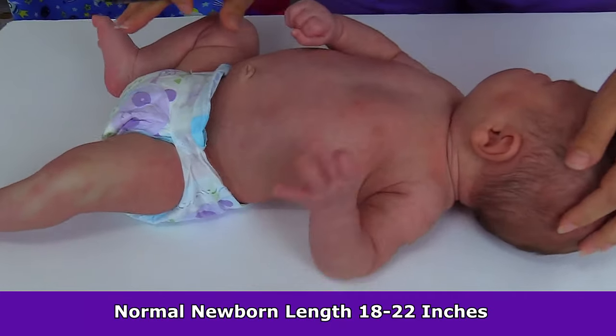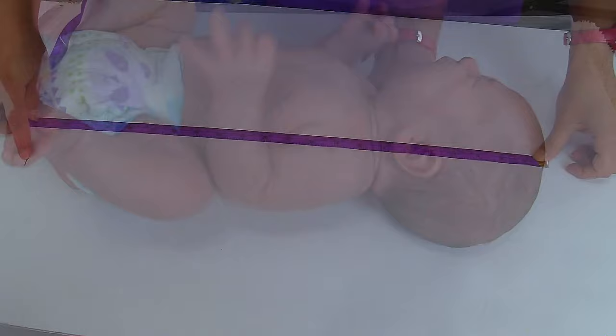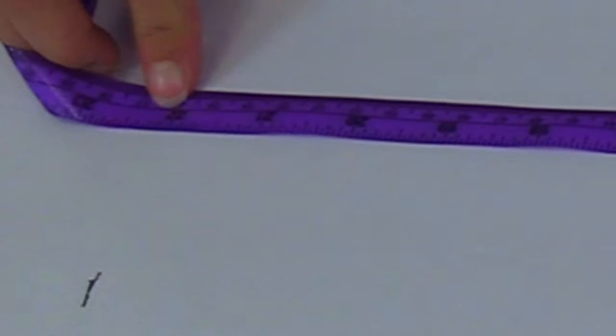A normal length in an infant is about 18 to 22 inches. We're going to gently lift the baby up and measure this — we're measuring in inches and the infant is 22 inches.